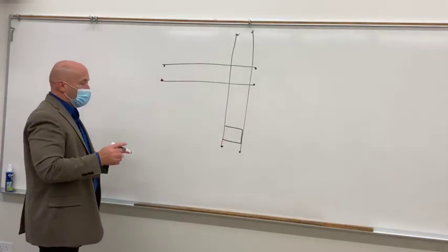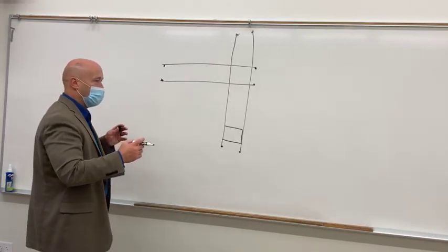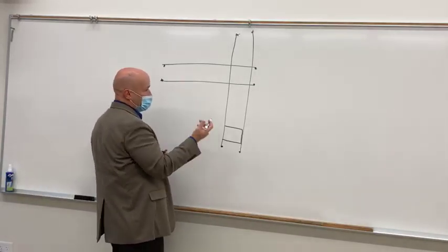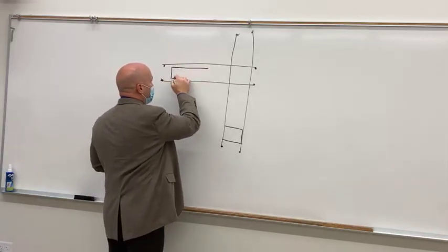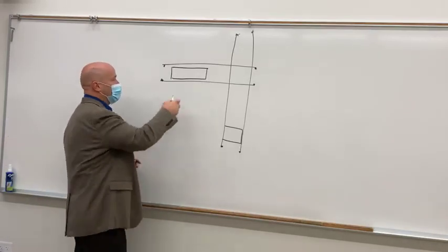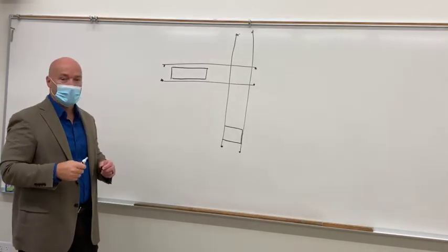In your fluoroscopy rooms, you got a totally different set of x-rays and image receptors. So inside of the table, which they call a couch, sometimes they'll call it a bed, x-ray bed, underneath the couch, inside of the table assembly, you've got a fluoro x-ray tube.